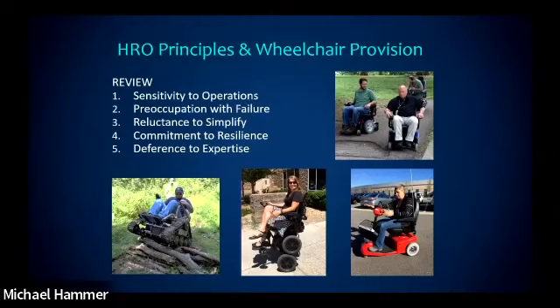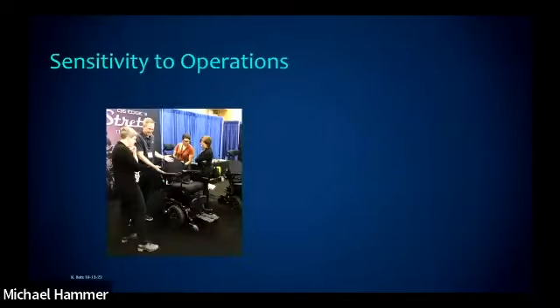But getting in those devices and understanding how they work, that is sensitivity to operations, right? If we just have a device that's shown to us and we go, yep, that's working out really well. How do you know? You got to know how to drive these things. You got to know how to perform wheelchair skills. You got to understand the impact of making an adjustment. You move that rear wheel forward because it's the right thing to do until it's too far forward. And then that's a problem because someone's going to flip over backwards when they go up their ramp, right? So just different opportunities to apply these principles to what we do.